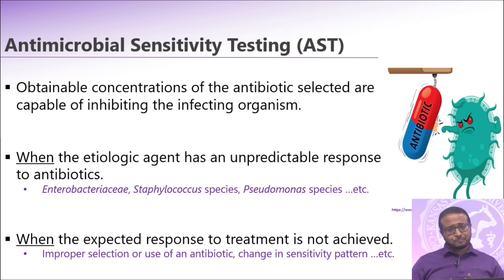And although most of our discussion today is going to be about bacteria, the basic knowledge and the broad spectrum of what we're going to talk about is very applicable to fungi as well. So I think the second question that would come to mind is, when should we run antimicrobial susceptibility testing, right?